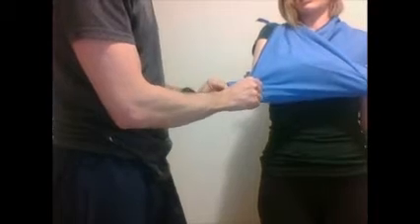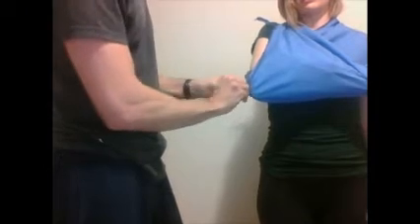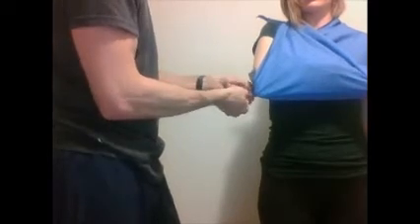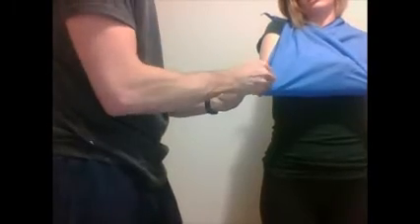So if I were to turn the patient, you could see around the back here, what I've got is the two ends of the triangle bandage. Okay, and we're just going to tie those into a square knot. Careful not to catch any of their hair. And then back on this side, we're going to finish this off by taking any of the excess material that we have around the elbow, and we're just going to twist to use up that material. If you had tape, you could also use tape to secure it, but if you just twist and tuck that material in, it should stay in place now.